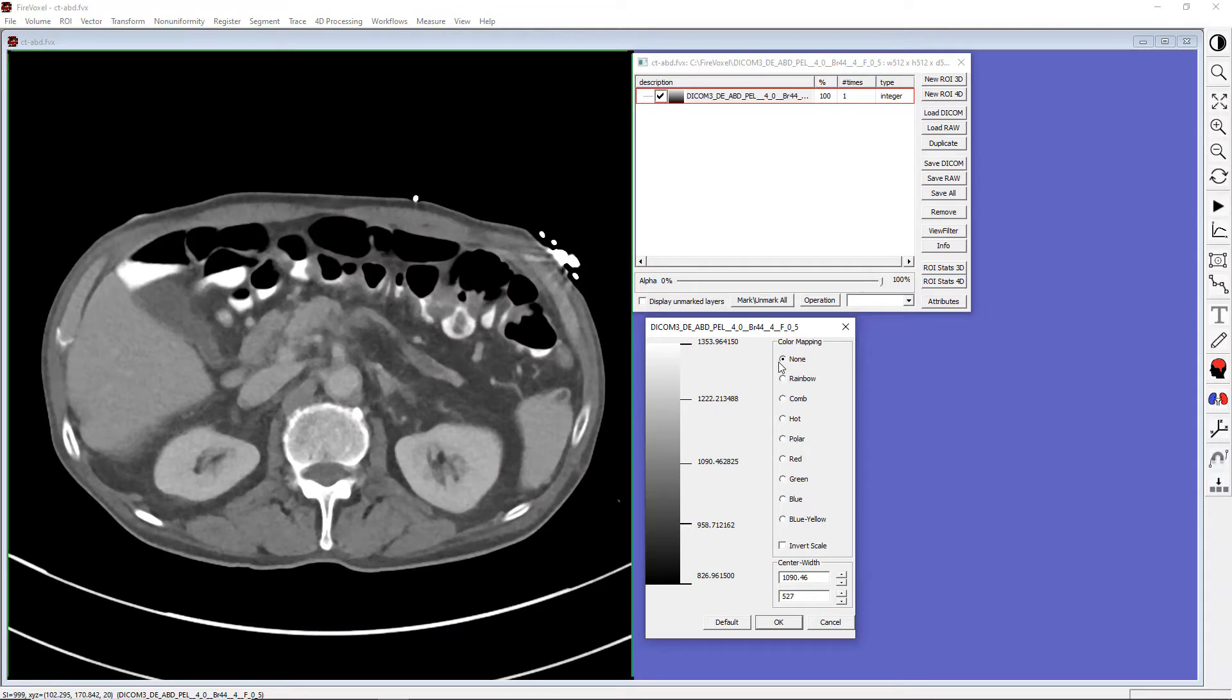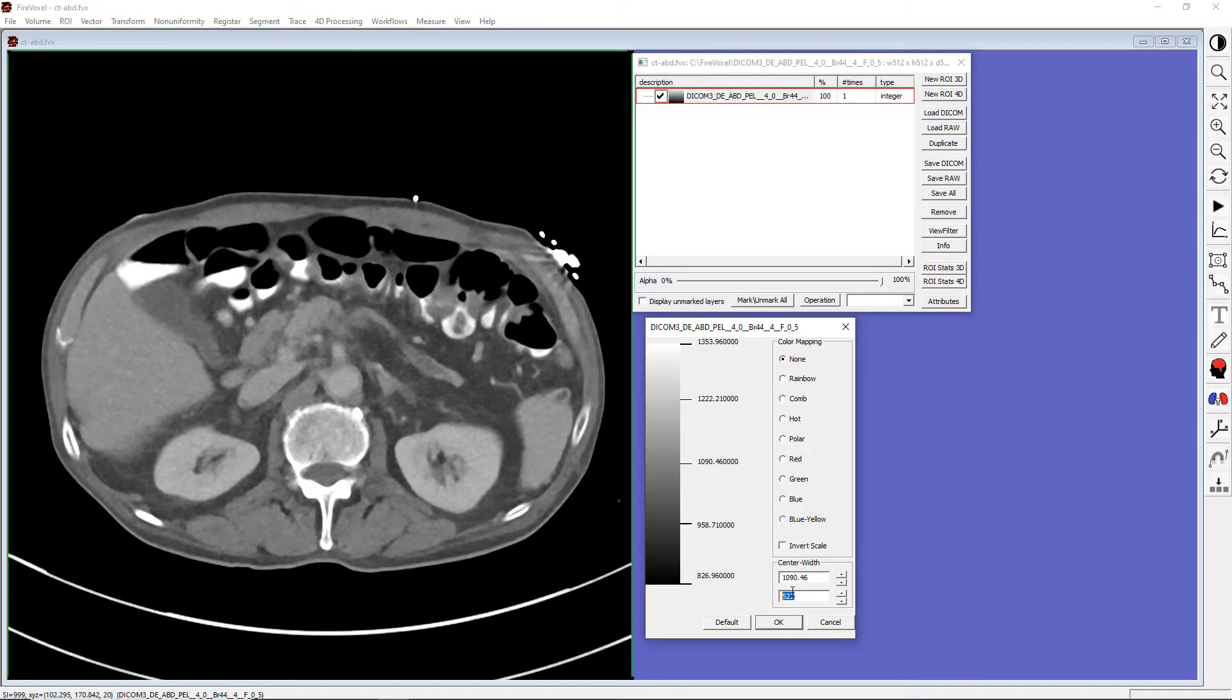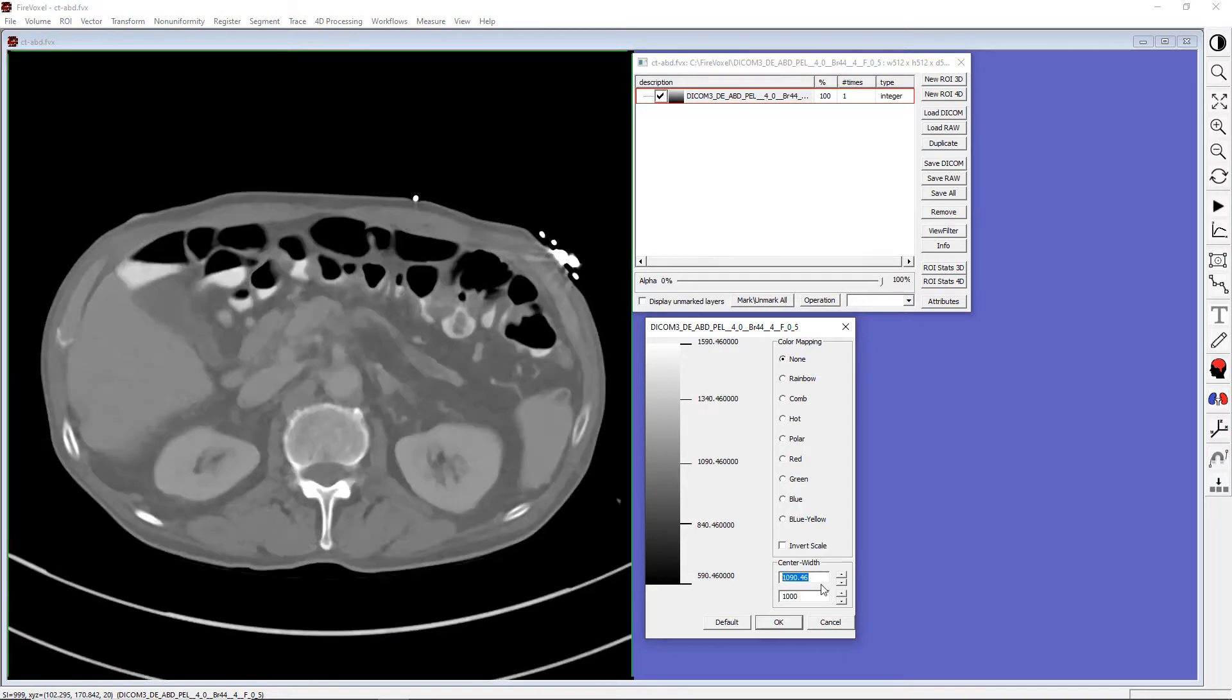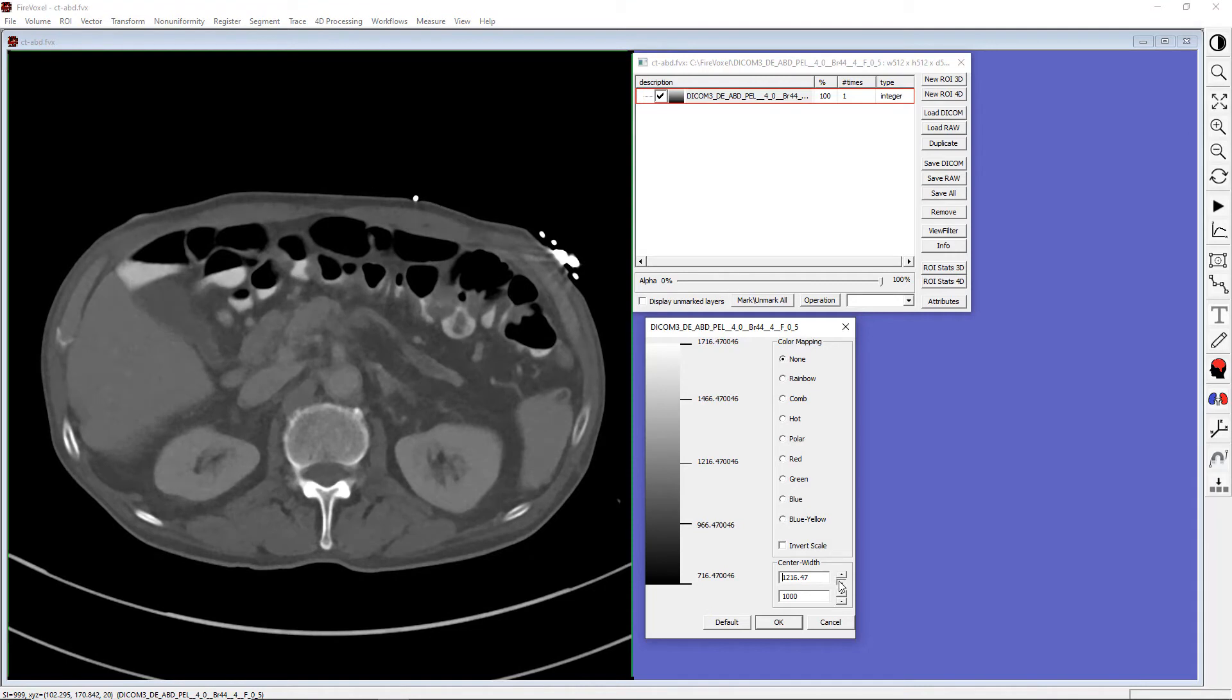Here on the left is the grayscale color bar. The window width and center are also shown in these boxes on the lower right. We can adjust the width and center by typing in values or using the up and down buttons. If we want to undo these changes, we can click Default.